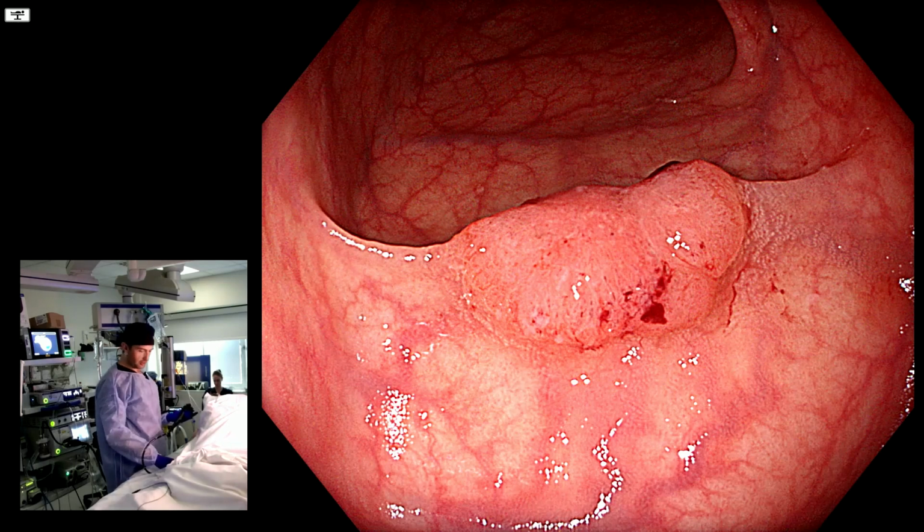So welcome. One of the key things that you have to be able to do as a colonoscopist, he says holding a gastroscope, is be able to identify cancer within colorectal polyps. And it's really important you freeze the image. Like, photography is everything. This is a beautiful photograph right here. Why is it a beautiful photograph?